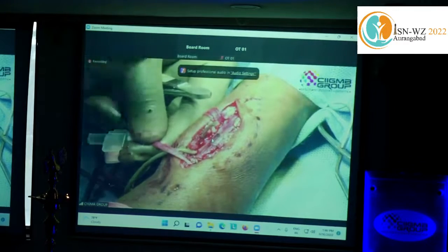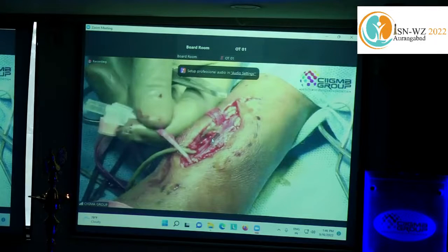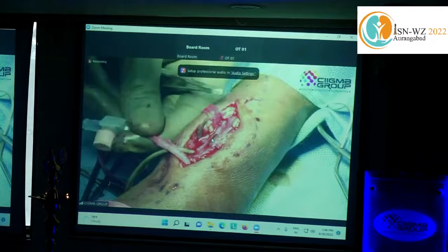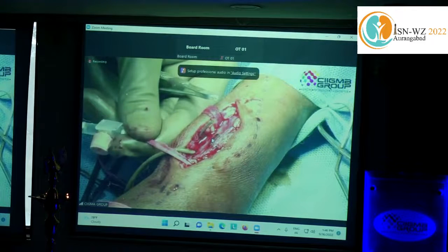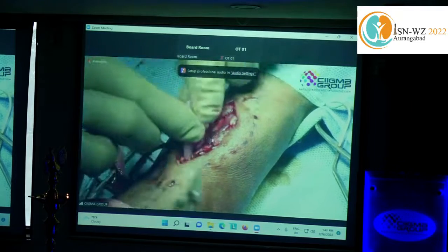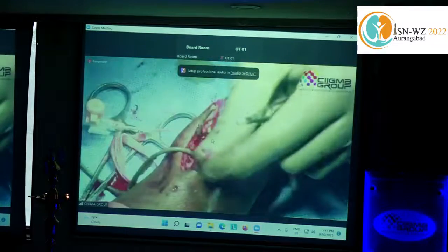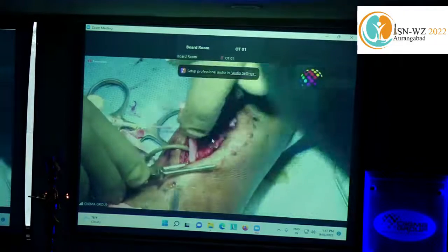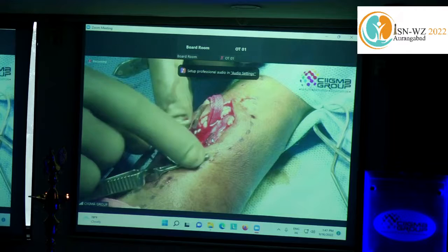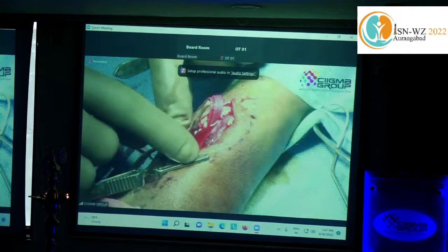So I don't find any obstruction proximally. Flush the vein, it will get dilated. Flush with at least 20 to 25 ml of saline with heparin. Once you are done with this flush, always make sure your orientation is appropriate and put a small bulldog here. If you see, I put this bulldog above the skin so that it will not damage the vessel wall. So that is one.